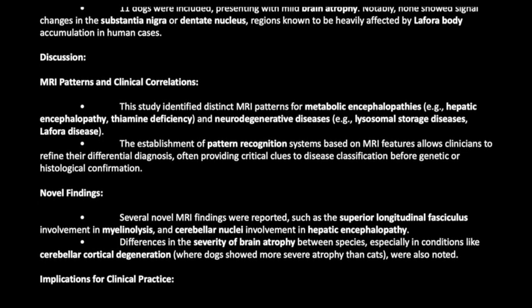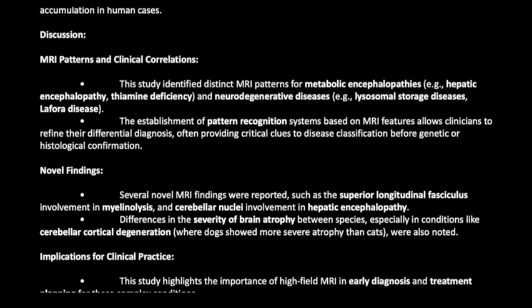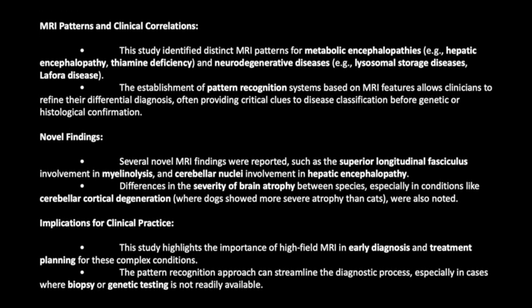Implications for clinical practice: this study highlights the importance of high-field MRI in early diagnosis and treatment planning for these complex conditions. The pattern recognition approach can streamline the diagnostic process, especially in cases where biopsy or genetic testing is not readily available.